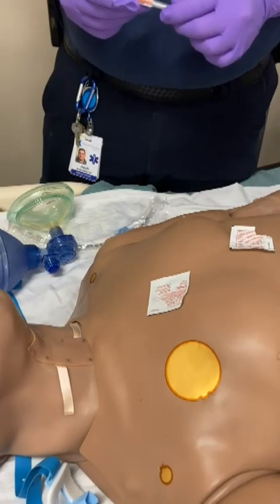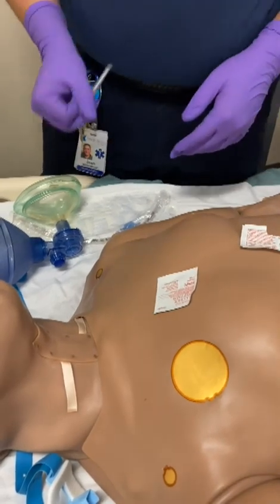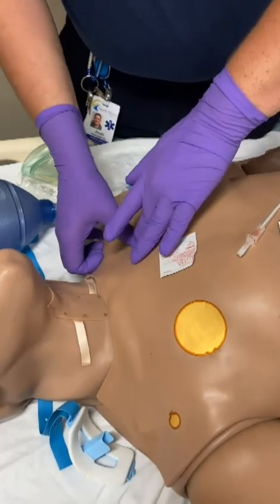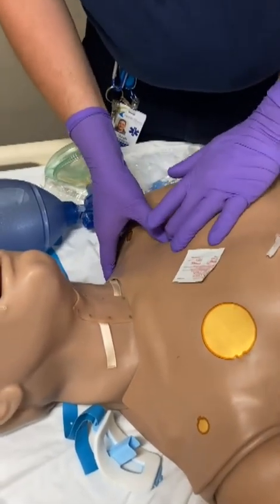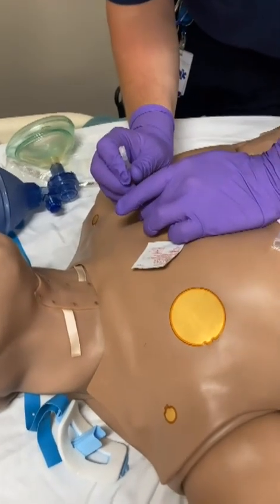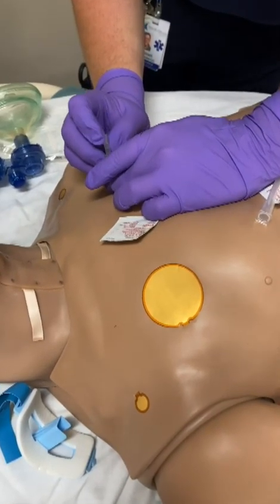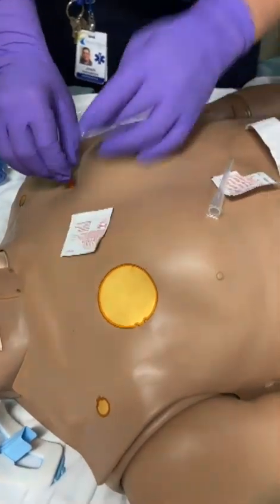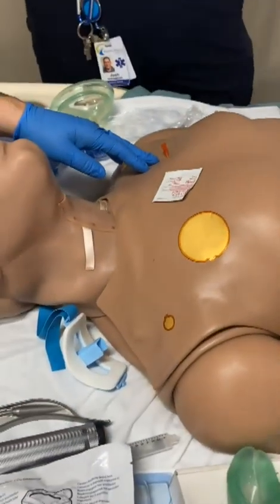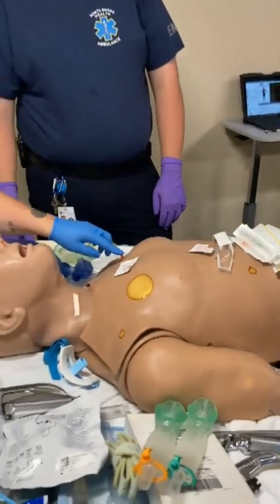All your supplies should always be out before you do this life-saving procedure. What kind of angle are you going to go in? So he's ready — this patient is really going to struggle and you're going to have instant relief if you have a good gauge, and it is amazing. When you're ready, with force push down. Tell me what you're feeling — do you feel resistance, do you feel bone? That's perfect. He pulls out — in these pneumothorax kits you have the 14 gauge and then some kind of stability measure to keep this from getting flimsy.